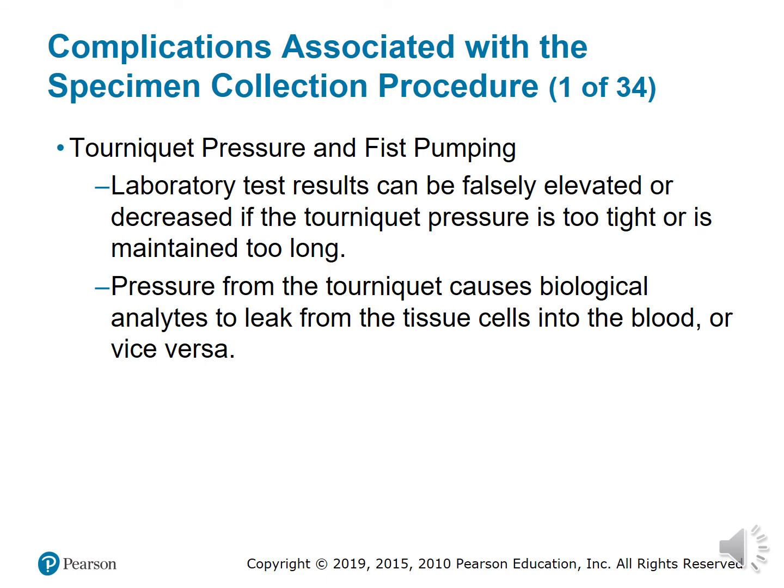All right, specimen collection: complications associated with the specimen collection procedure, tourniquet pressure, and fist pumping. Laboratory test results can be falsely elevated or decreased if the tourniquet pressure is too tight or is maintained for too long. So how you put it on matters. We said the tourniquet can't be on for more than a minute, so we stress that.